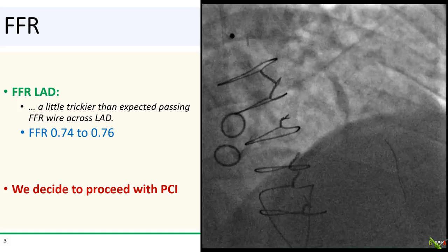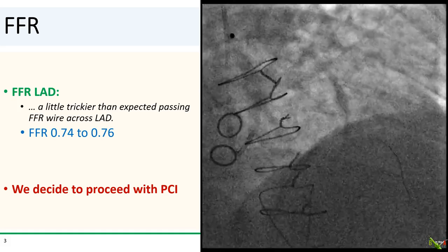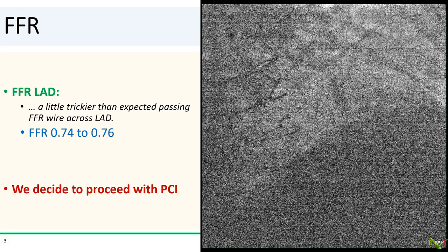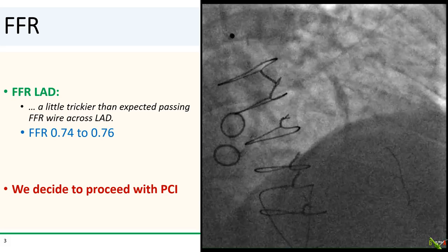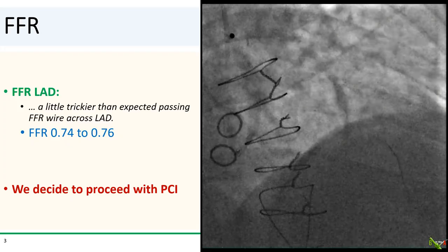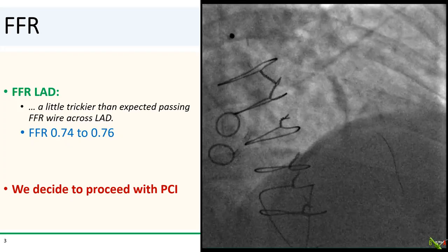It was a little trickier than expected passing the FFR wire across the LAD, but FFR eventually turned out to be positive, hovering between 0.74 and 0.76, so we decided to proceed with PCI of the LAD.